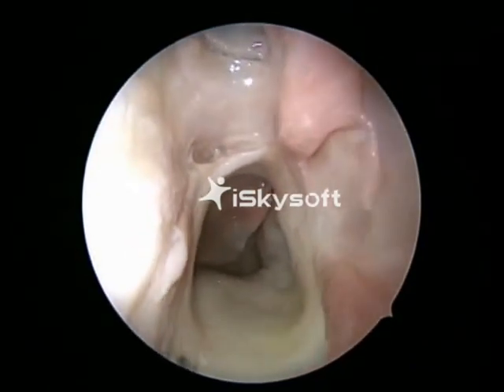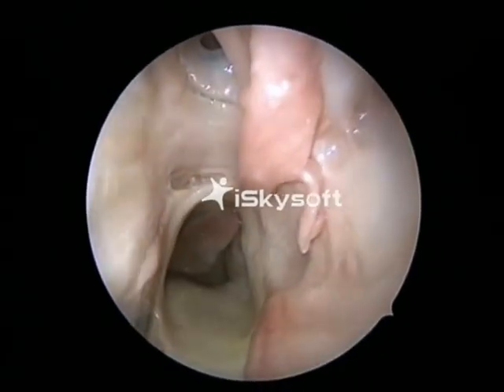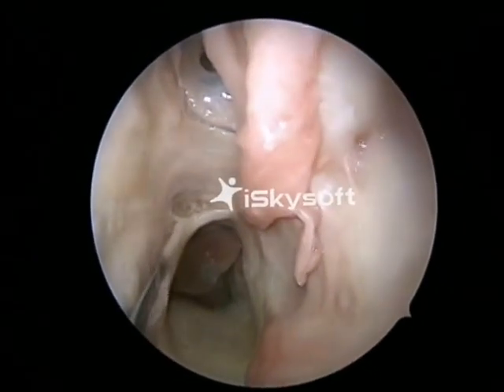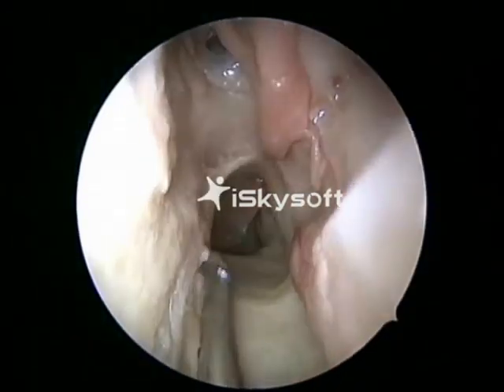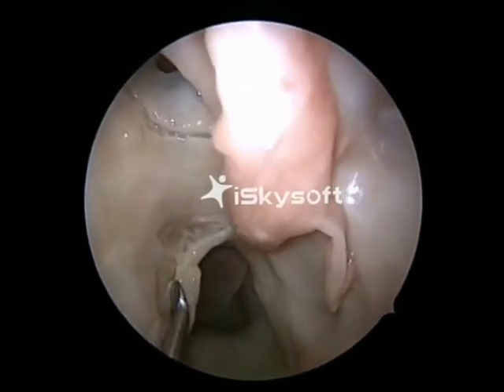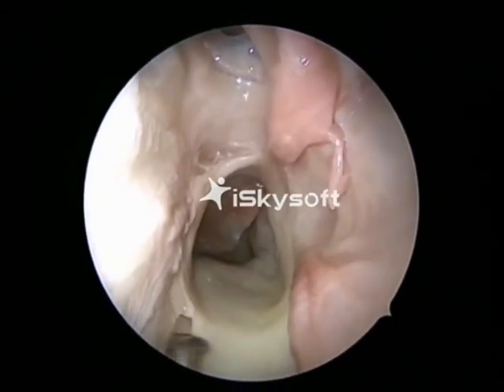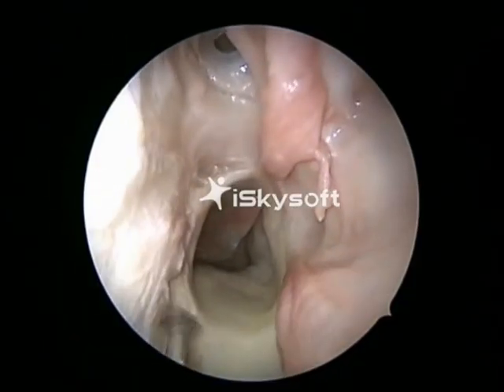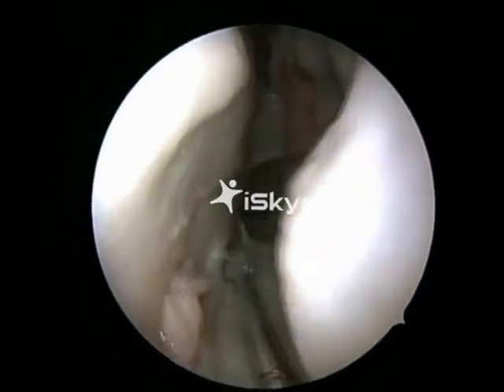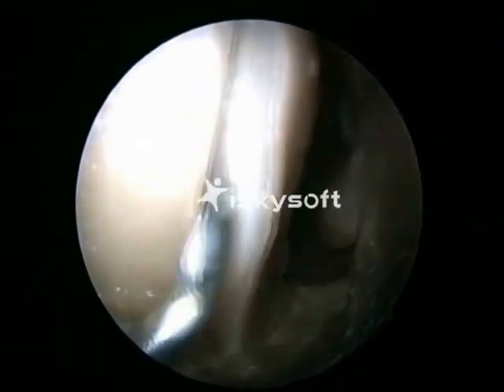A laser or a diathermy can be used to make this incision, because in a live situation there can be bleeding while making this incision. That's a plane of dissection.